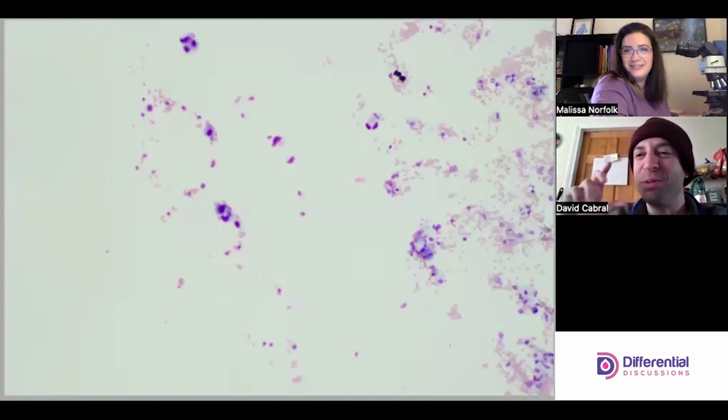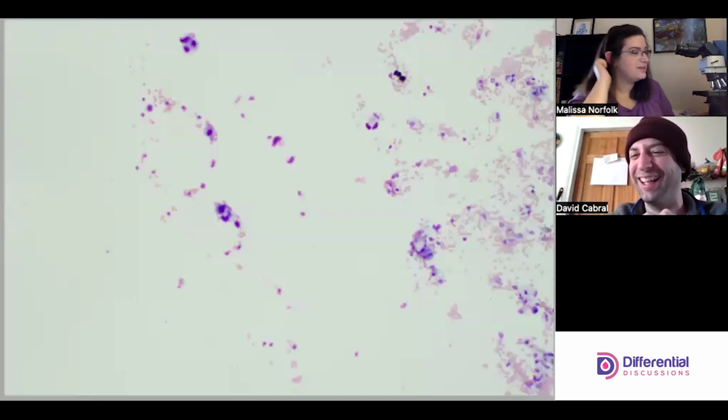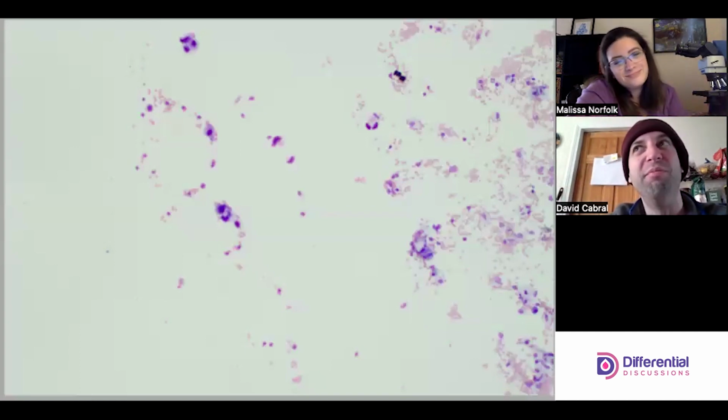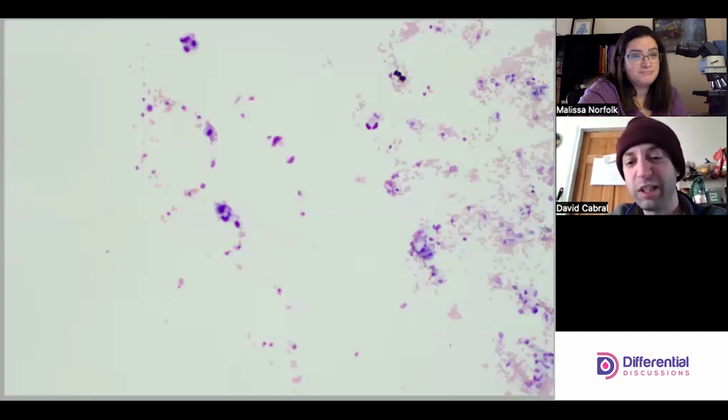You get those pleural fluids that have the big gelatinous blob clots in them. I think it was Steve that told me that pleural fluid has a lot of tissue factor in it. And that kind of makes sense, right? You see these clots forming. Also makes sense because, hey, it's the lungs, right? The lungs are important.